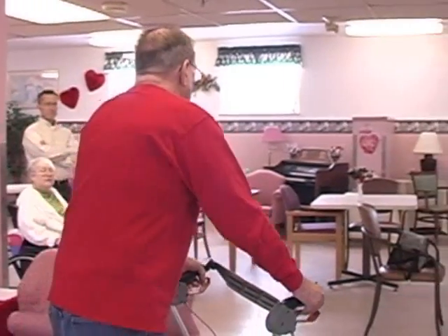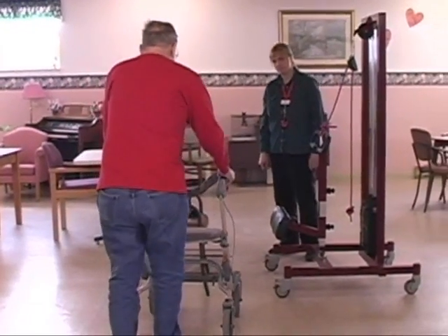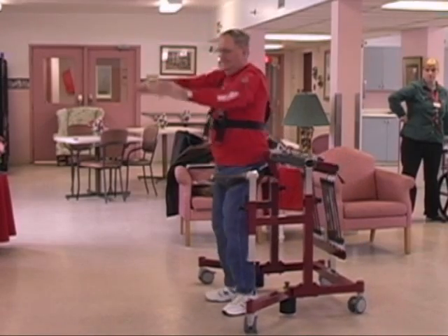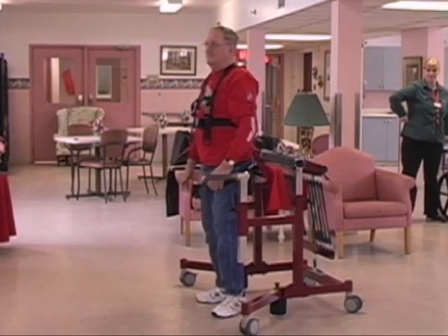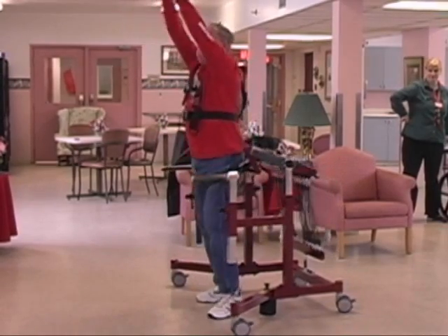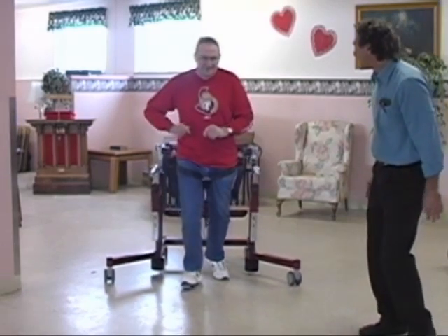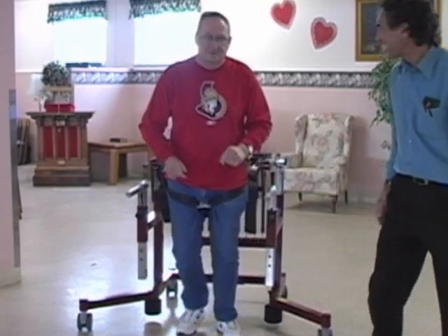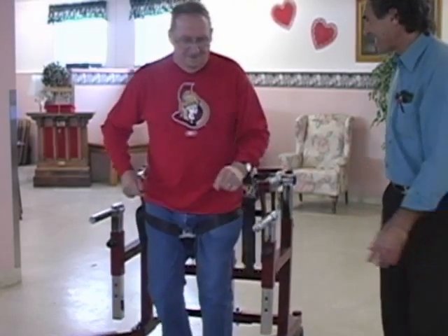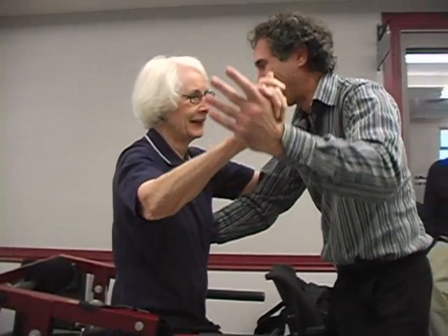For example, relatively healthy residents who depend upon walkers to mobilize can safely and effectively improve their stability in the Bungie Mobility Trainer with the goal of improving the safety of their gait or even of resuming independent walking. The Bungie Mobility Trainer gives seniors the opportunity for safe trial and error practice and hence the prospect of regaining the ability to move with more confidence and independence.